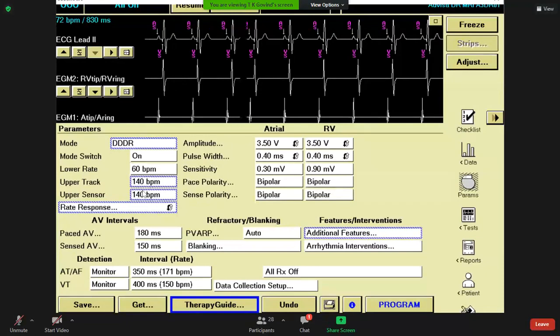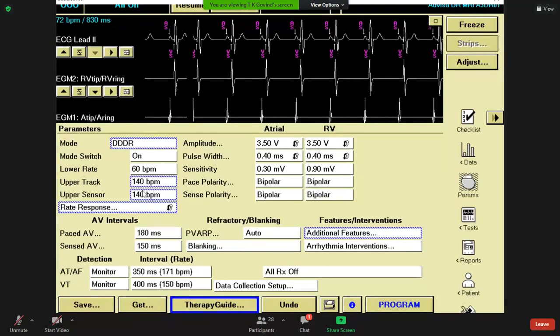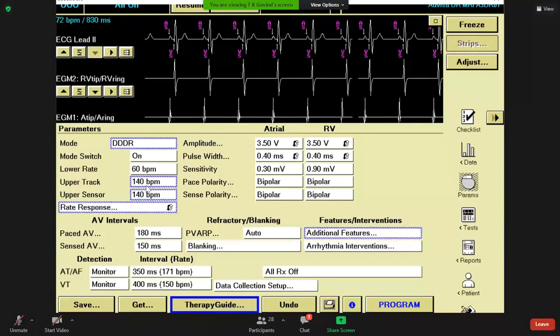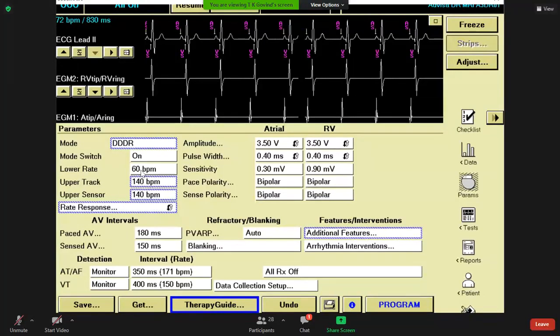But as you know, there are some pacemaker models, as Dr. Athar pointed out, which might switch to VVI mode, then that might cause symptoms. So when it switches to DDIR mode, then there is no problem. Medtronic pacemakers actually switch to DDIR mode when the device mode switches.